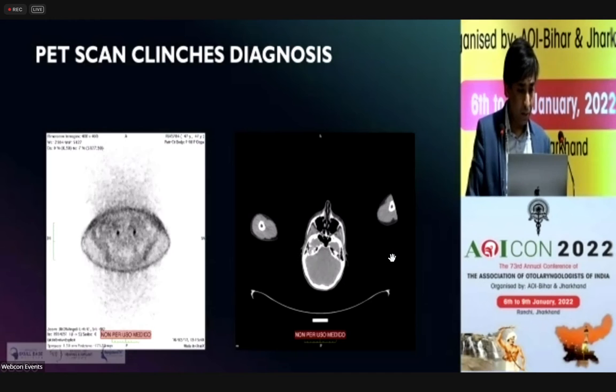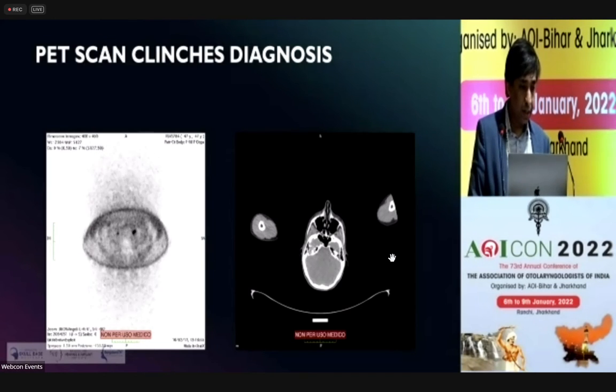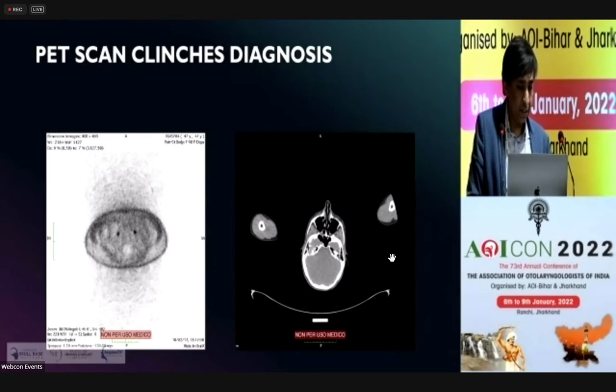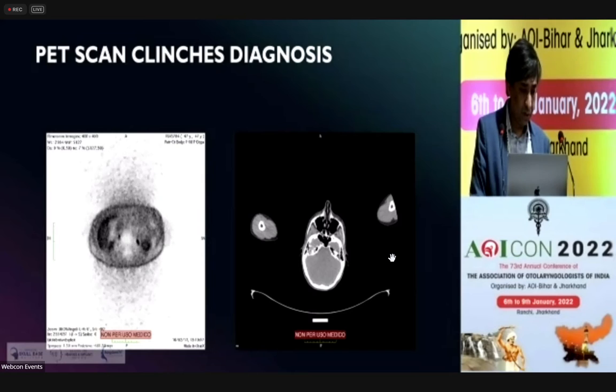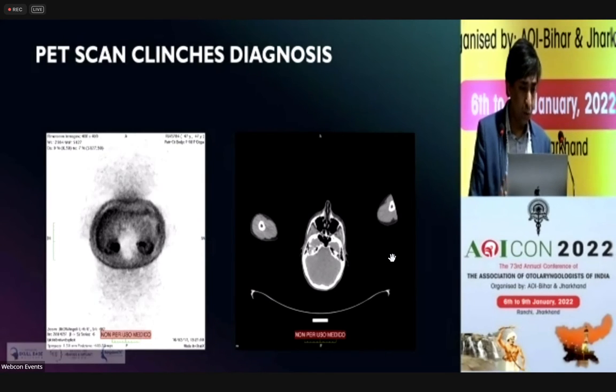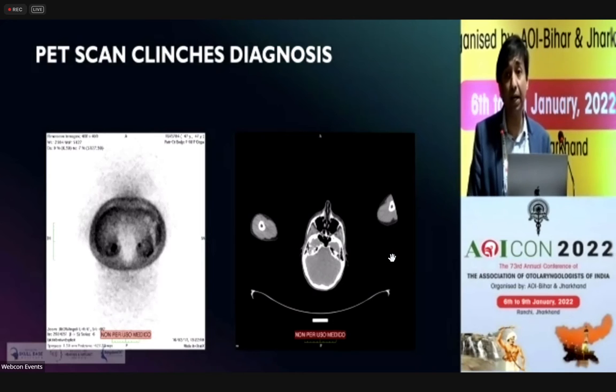So here now, they're all working. I don't know. So again, one of the 18F DOPA scans. I don't have control, unfortunately, but let's go through this, because this is a full body PET scan. This was for a vagal paraganglioma, one of my patients.